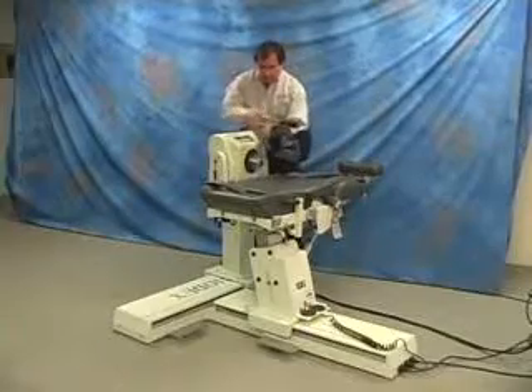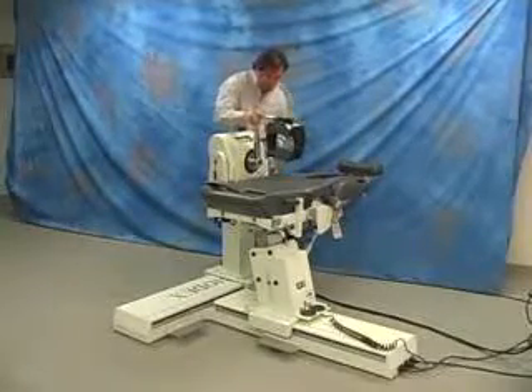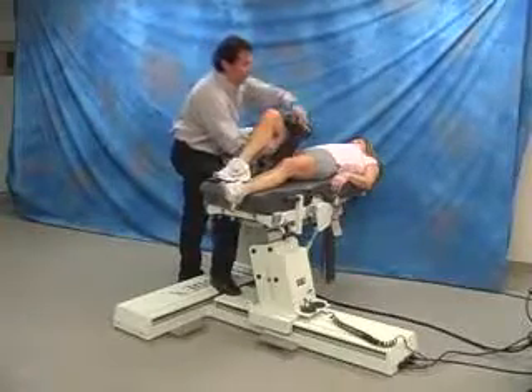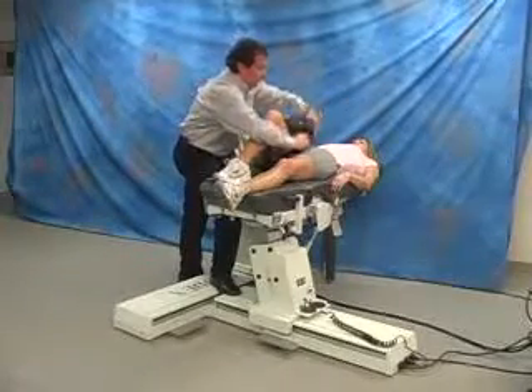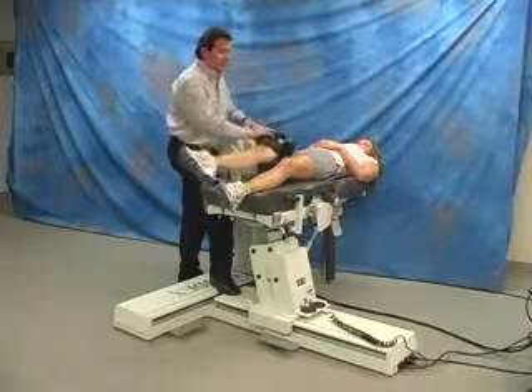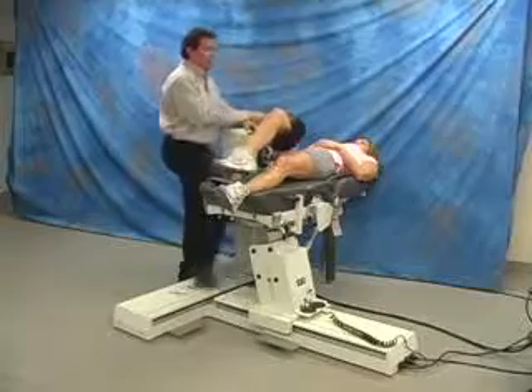Select the appropriate side hip attachment. Attach input tube to shaft aligning the red dots. Align axis of rotation and strap patient to the attachment. Set range of motion stops.